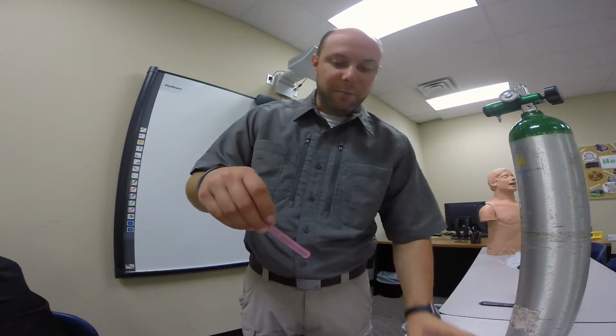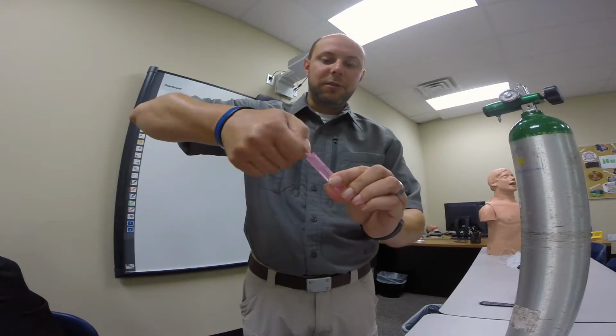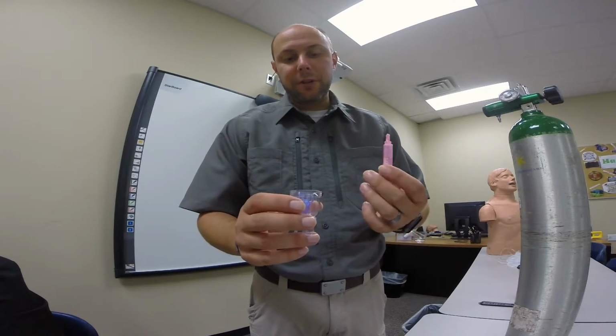And most medication is packaged this way for nebulizer. It's pretty easy to take off in a minute and squeeze in. Just twist the cap. You can discard the cap. And then you want to administer it into the reservoir.